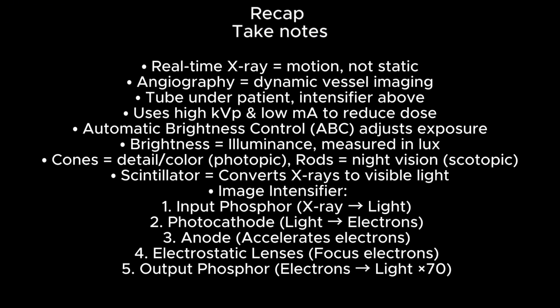So now you know fluoroscopy is more than just live X-ray. It's the product of decades of innovation and fine-tuning. From red goggles in the dark to amplified light through advanced electron optics, it's a system designed for clarity, motion, and safety. As a radiology student or tech, understanding this process is critical, not just for passing your tests, but for appreciating how we guide catheters safely, track contrast, and observe anatomy and motion every day.